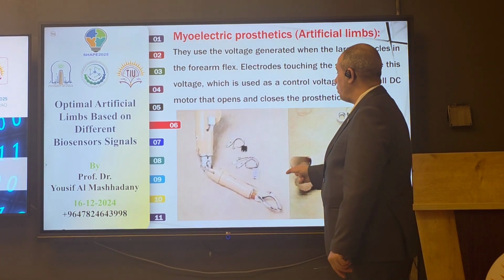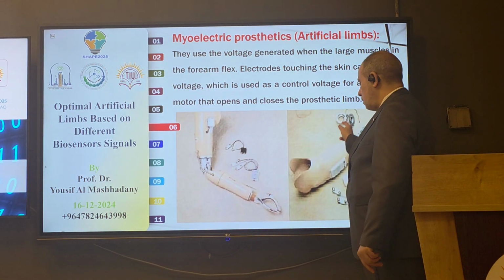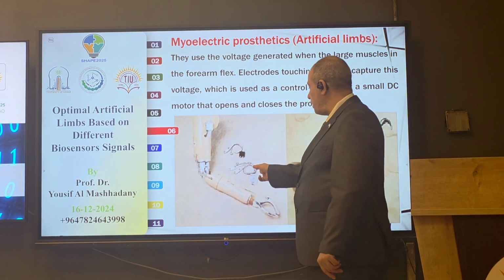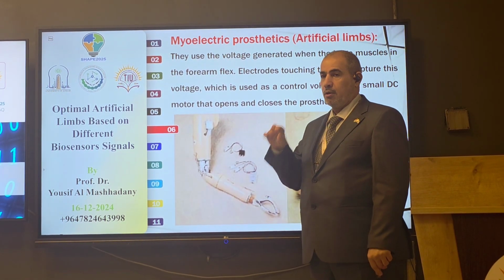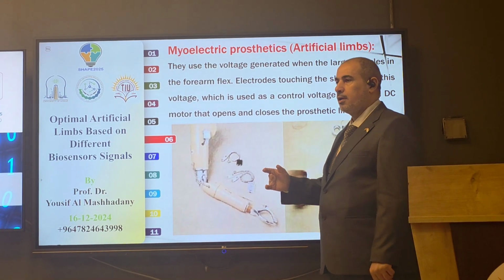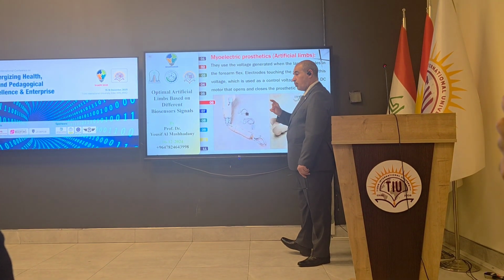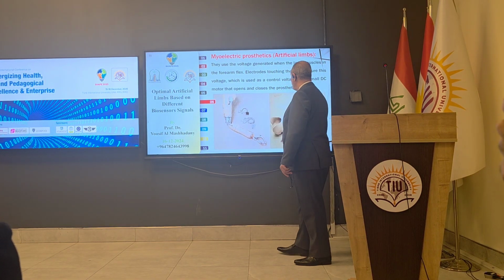This must contain a sensor, this EMG signal, electromyography signal, and a controller, and this is not just a controller, but a processing unit containing filtering, amplification, and calibration. Control is just calibration between the amplitude of the EMG signals according to the angle of the joints.